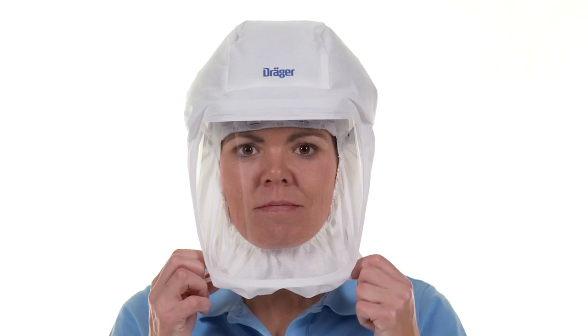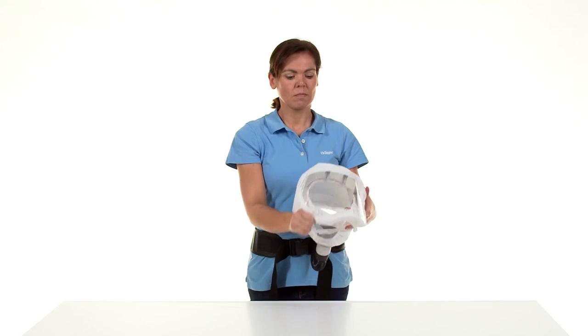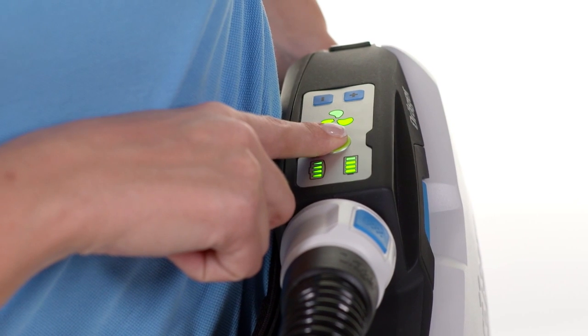Take off the hood by using the respective loops. Caution: do not switch off the unit until you have taken off the hood.